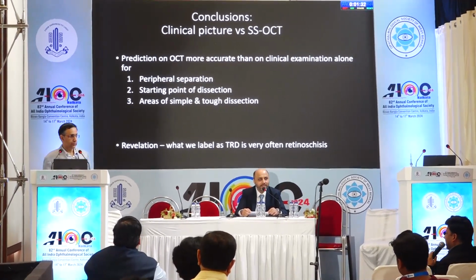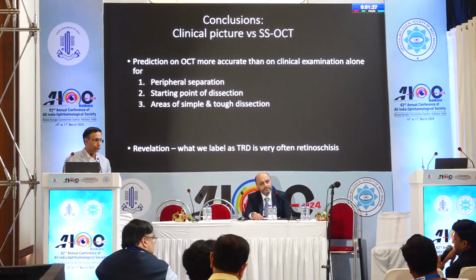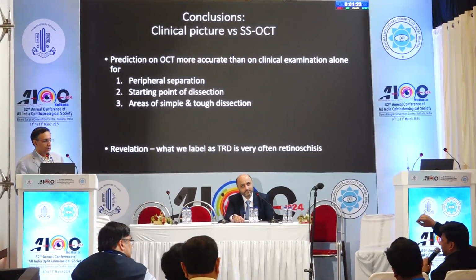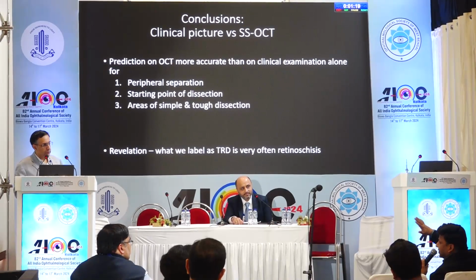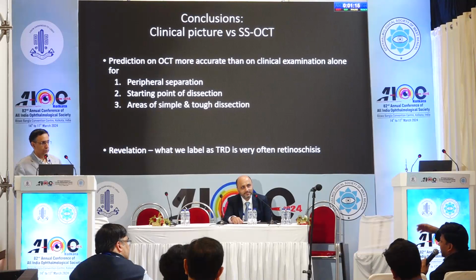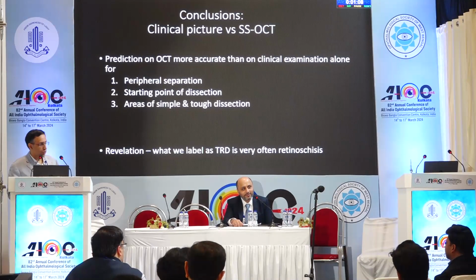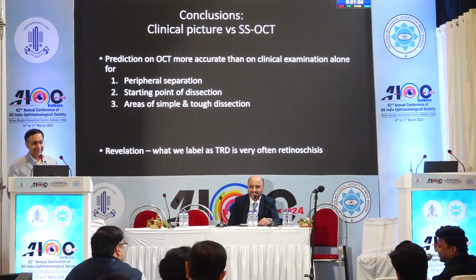One more sign I would like to highlight about the vitreous cases: once you have dissected all the membranes and you feel your vitrectomy is done, but there are small streak-like hemorrhages in the peripheral retina, it means that your vitreous is still present over there. It's still not gone, so you have to explore that. In that case, you can put some triamcinolone to identify that residual vitreous. You can remove it. That is popularly known as the red flag sign.